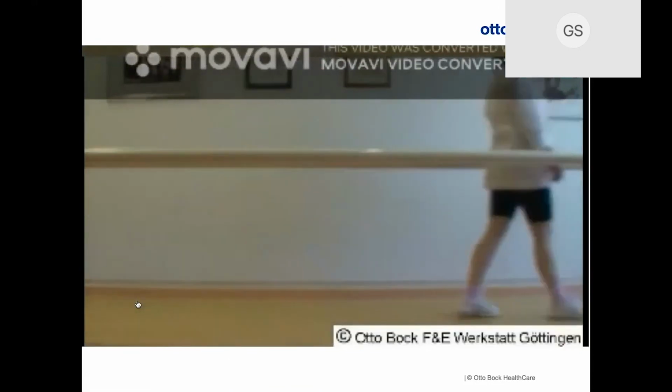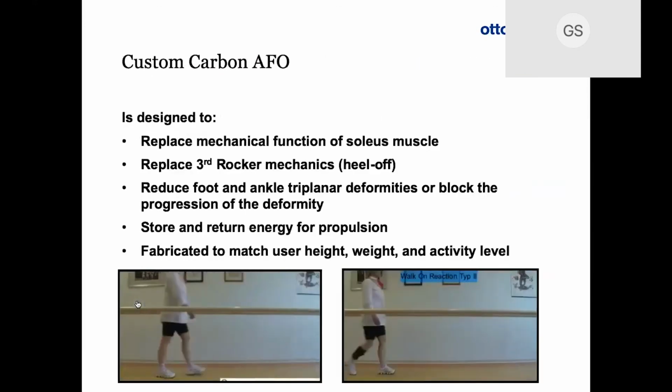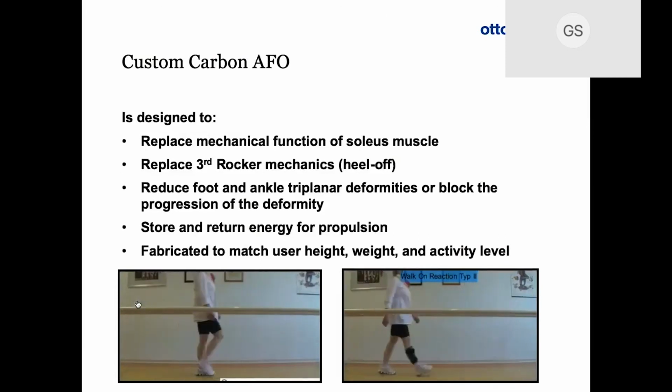And we'll go forward again. I want you to notice how there is that lack of drop-off in late stance. I guess it's side by side, yeah. So much faster in comparison, and look at where her shoulders are, look where the center of gravity is, and look at where that knee is in late stance.